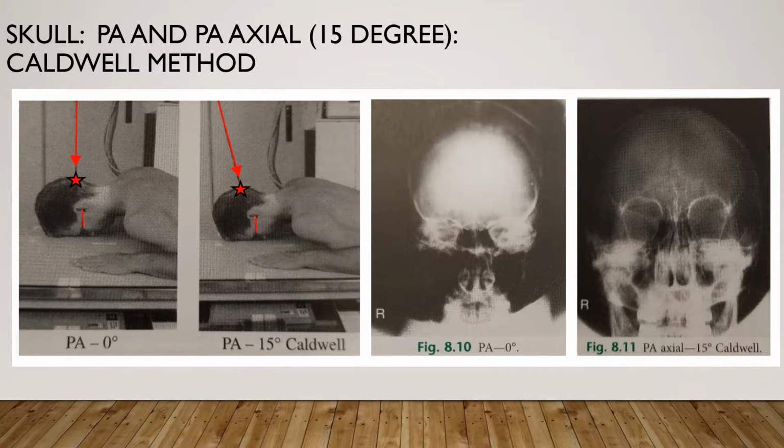Okay, so typically if you're going to have a patient in for a skull x-ray, you are going to be taking 4 views. The 4 views we're going to be taking are the PA, the Towne, and both laterals. Now, back about 20 years ago, we were x-raying a lot of patients' skulls. We tend not to x-ray the skull that much anymore, and it's because of the fact that we have CAT scan now. So more often, we are going to have the patients going through a CAT scan for skull x-rays.